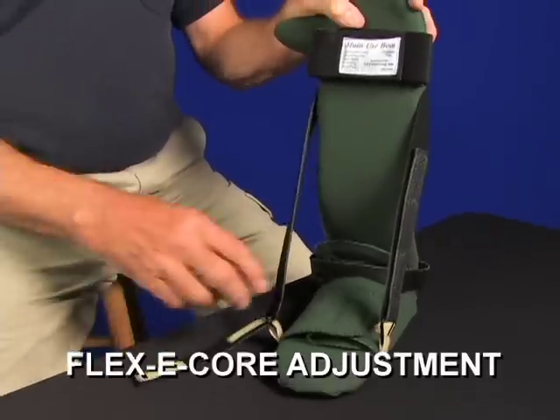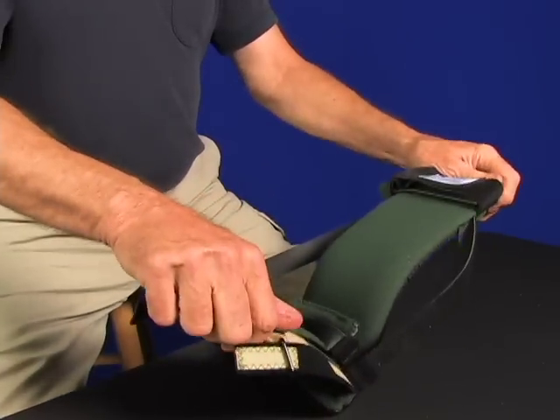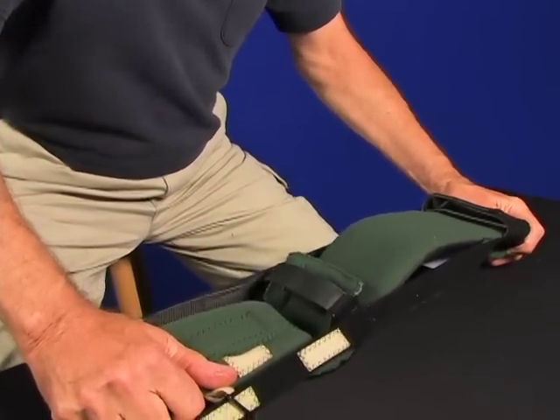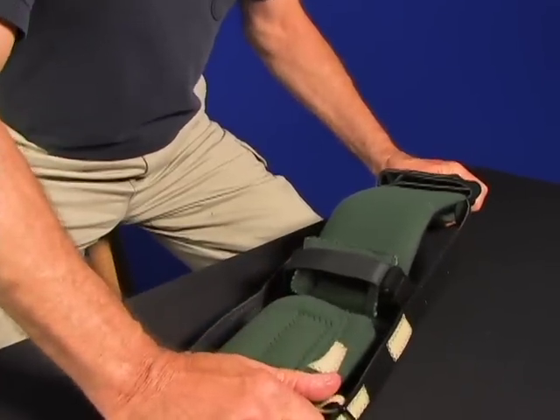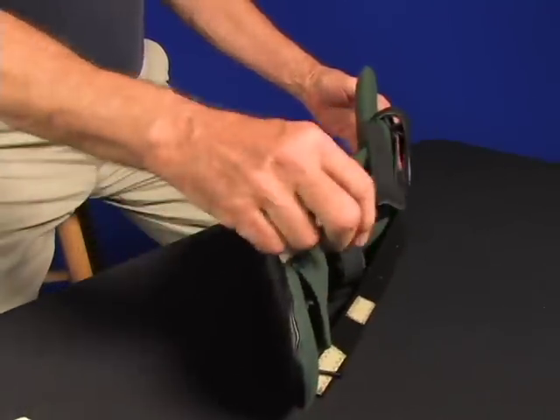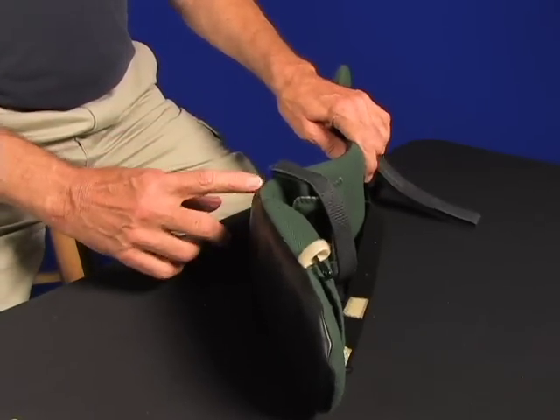The basic adjustment is matching the foot length to the user. Start by loosening the straps so that you can open or flatten the boot out. You can adjust the foot length of the boot by rebending the FlexiCore structure. Once you have it flattened out, you can shift the heel bend one way or the other to make the foot piece longer or shorter.